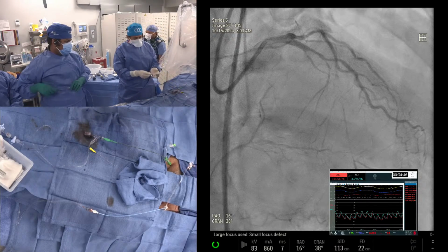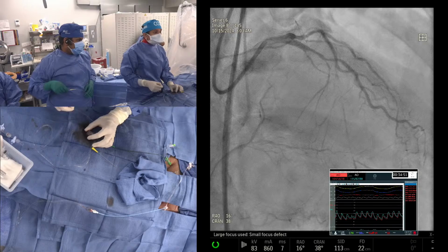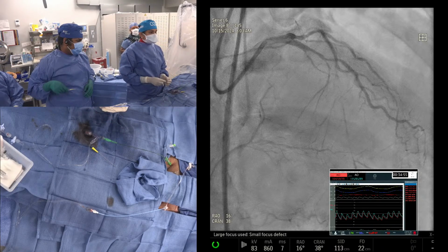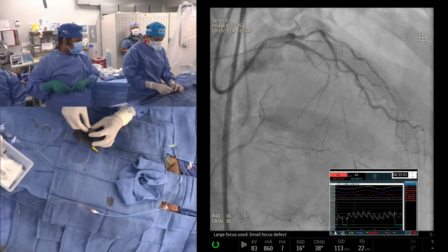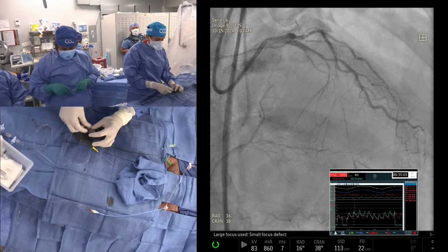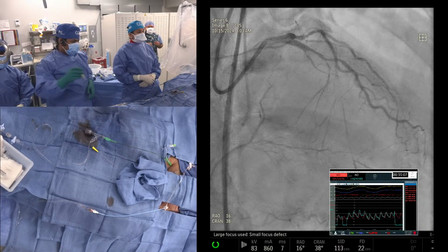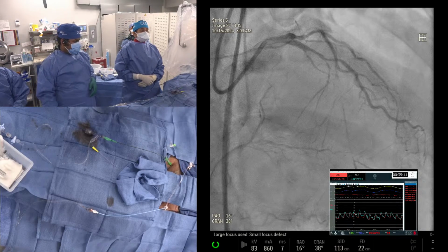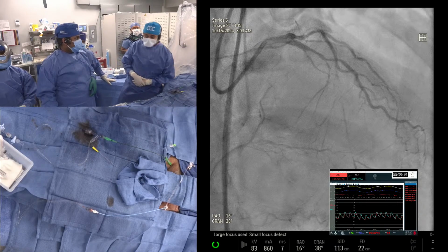Okay, let's go to presentation while we are getting your first wire. You're doing a fine cross and a Fielder wire, and what wire will you be using after that? The first wire. What would people use? You could go with Fielder. A lot of people like Fielder XT, or Gaia. No, for the first wire you can still try Pilot 50, which people like. So Fielder XT, Pilot 50.